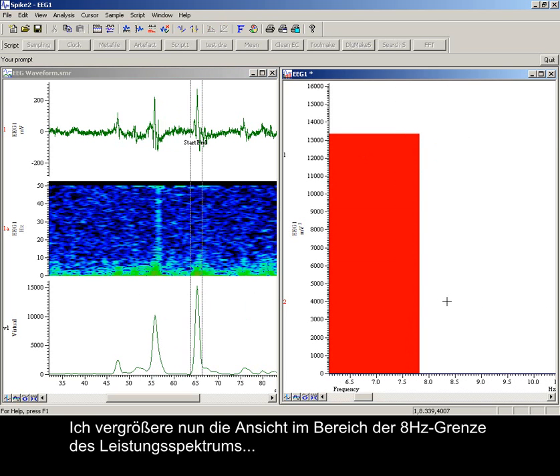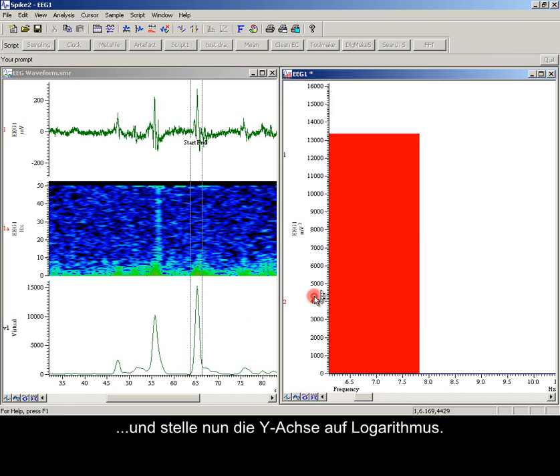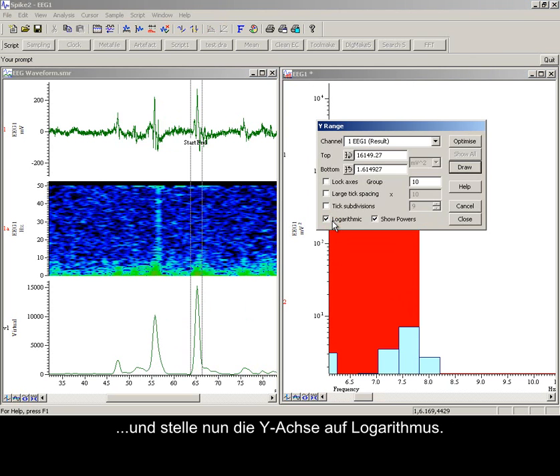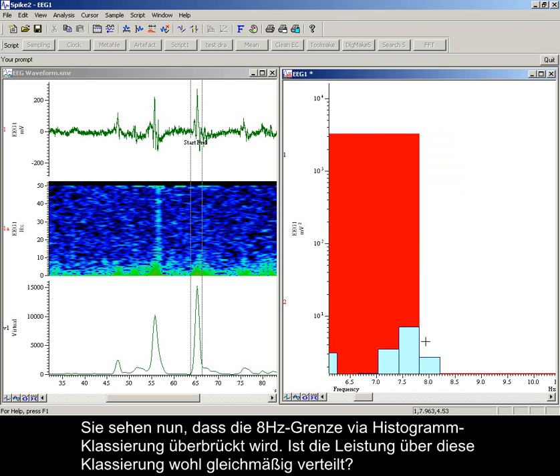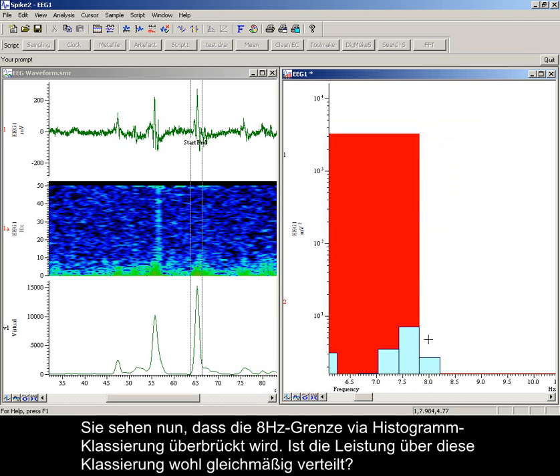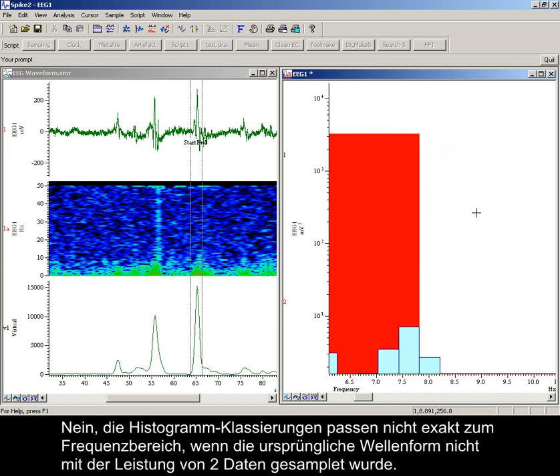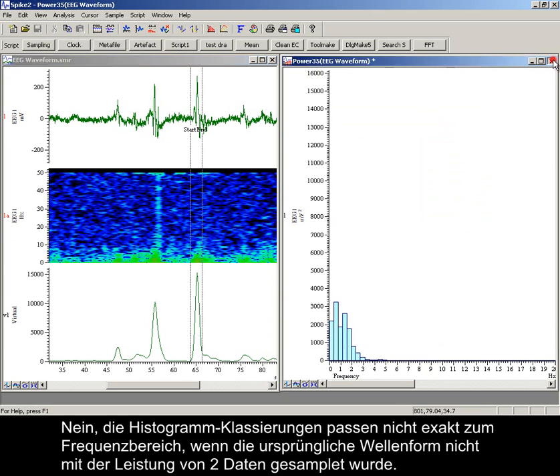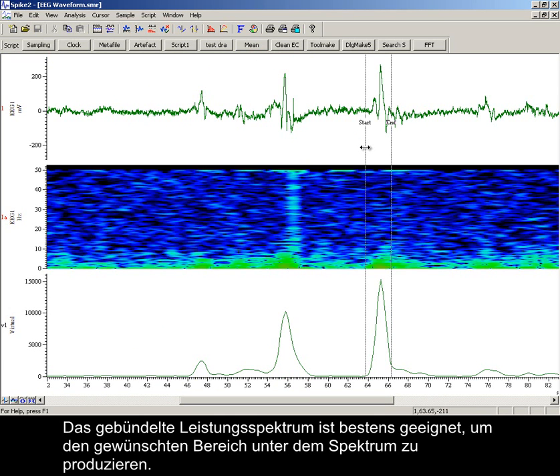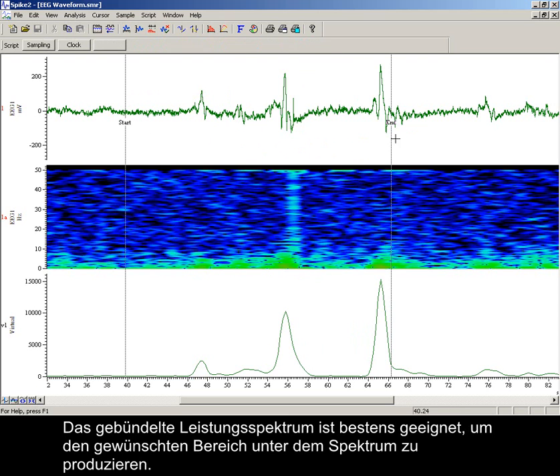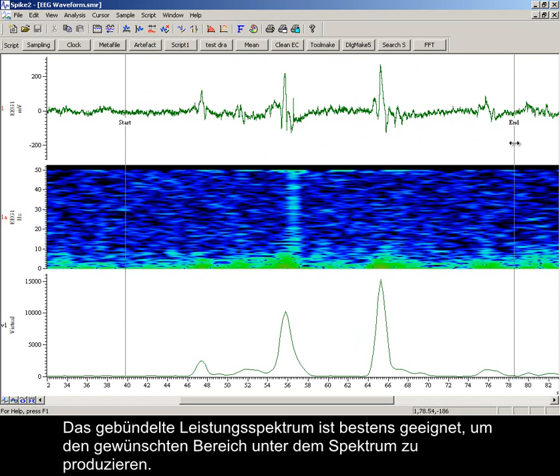Zooming into the 8 Hz boundary of the power spectrum and setting the y-axis to logarithmic, you can now see that the 8 Hz boundary is bridged by a histogram bin. Do we assume that power is evenly spread over this bin? Unless the source waveform was sampled at a power of two data points, the histogram bins will not align and we should make no assumptions. Banded power spectra does its best to provide the area under the spectrum that you have asked for.